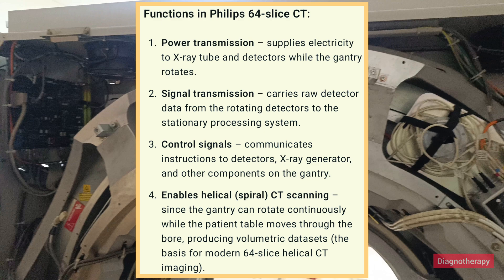The functions of the slip ring are: first, supplying electricity to the x-ray tube and detectors while the gantry rotates; second, signal transmission — carrying raw detector data from the rotating detectors to the stationary processing system; third, communicating control signals to detectors, x-ray generator, and other gantry components; and fourth, enabling helical/spiral CT scanning, as the gantry rotates continuously while the patient table moves, producing volumetric data sets — the basis for modern 64-slice helical CT imaging.